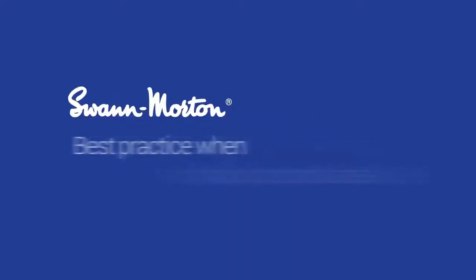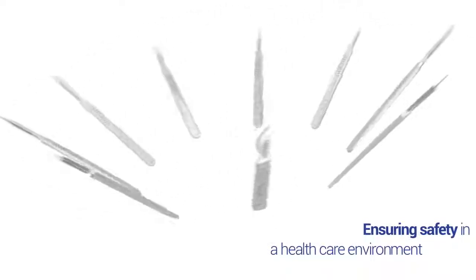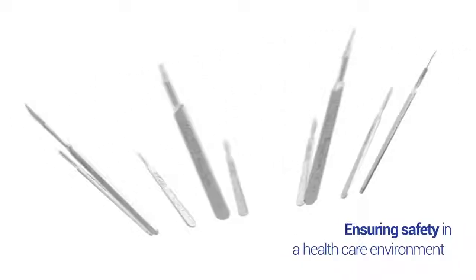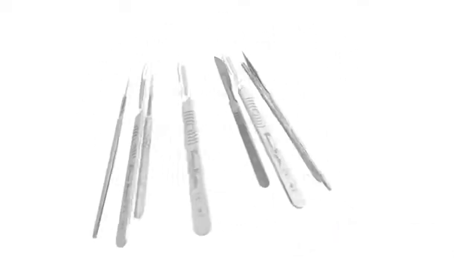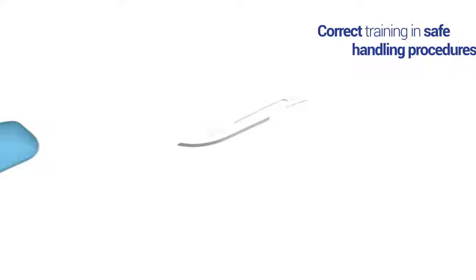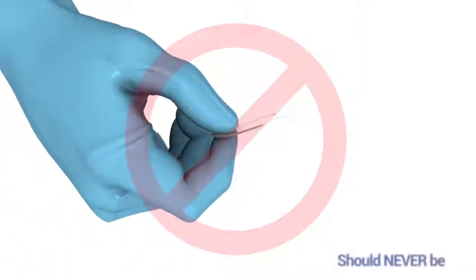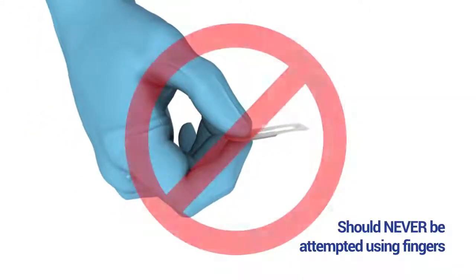When surrounded by surgical sharps within a healthcare environment, it's important that best practice is applied at all times to ensure your own safety and that of your colleagues. Incorrect handling of surgical blades can potentially lead to accidental sharps injuries, as well as damaging the blade's cutting edge, which will adversely affect its efficiency during use. The risk of sharps injuries can be reduced with the correct training in safe handling procedures and best practice when fitting and removing a blade from the handle, which should never be attempted using your fingers.